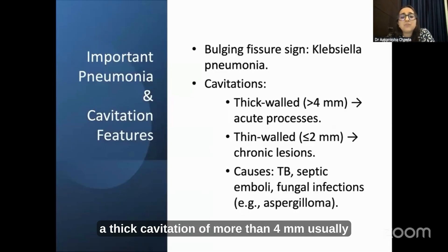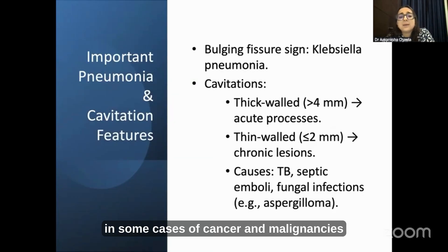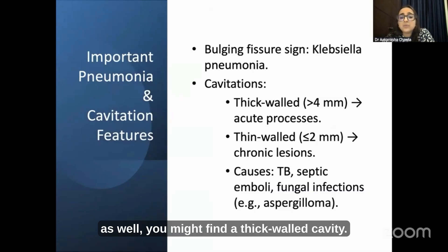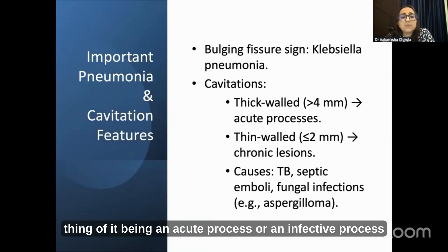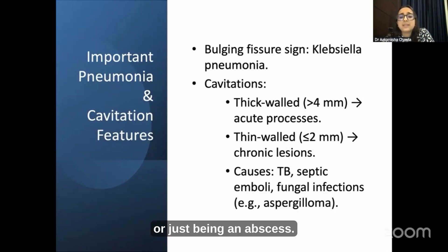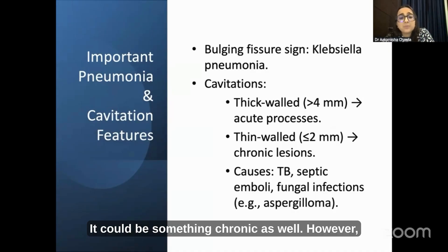With cavitations, a thick cavity wall of more than 4 mm usually suggests an acute process. However, in some cases of cancer and malignancies as well, you might find a thick-walled cavity. So don't just assume it is always an acute or infective process or just an abscess — it could be something chronic as well.